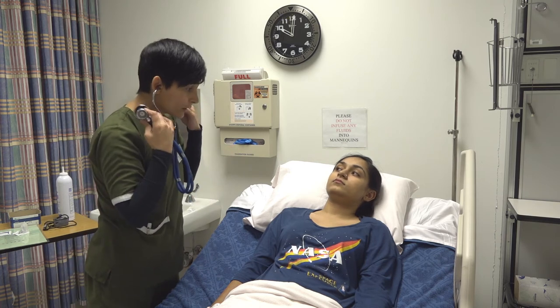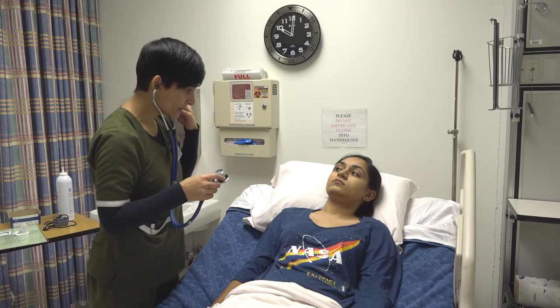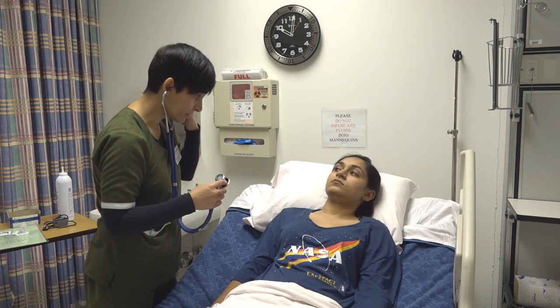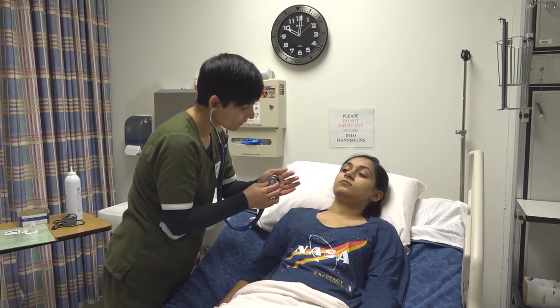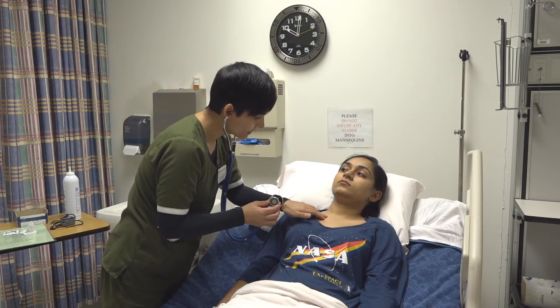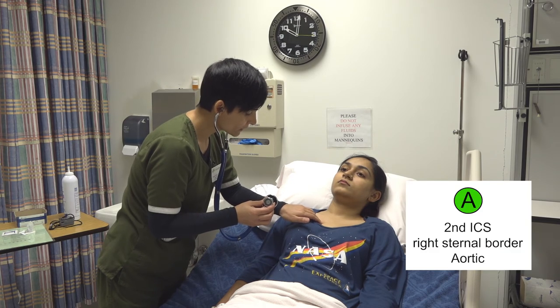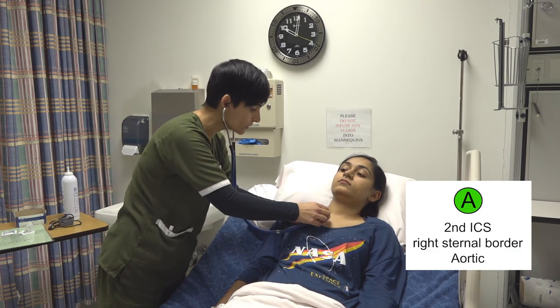Now I'll be listening to five different spots, different landmarks, and I'll name them at the same time. This is aortic — second intercostal space, right sternal border.